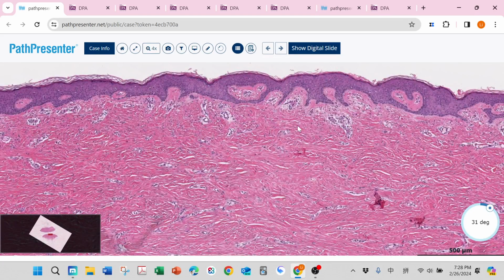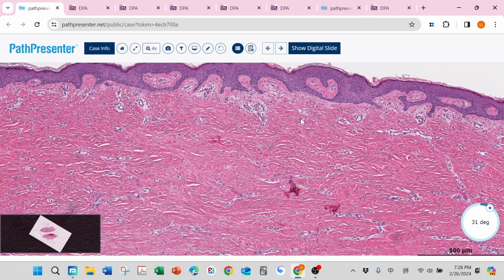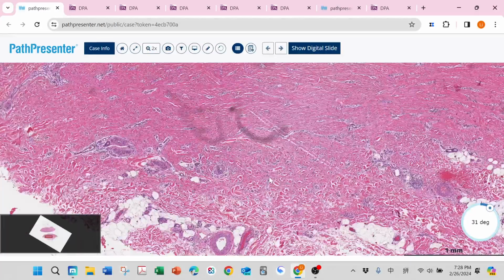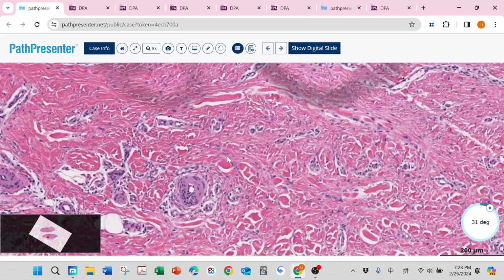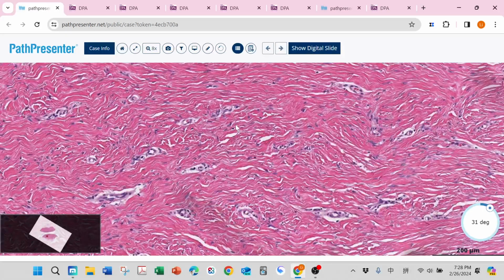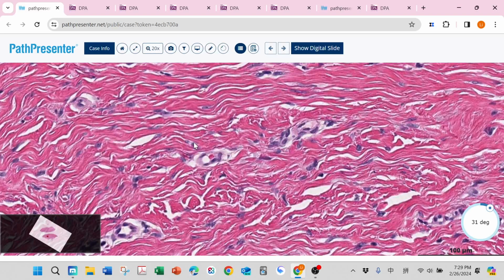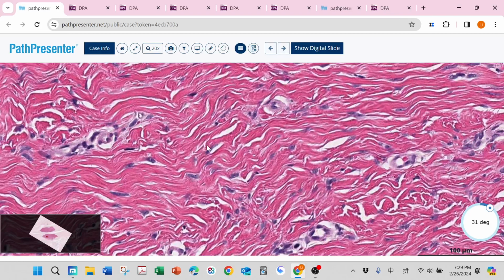from the superficial dermis, papillary dermis, all the way down, even going into subcutaneous fat. And then in the periphery, you usually see this characteristic collagen trapping by the spindle cells. When you look at the cytology of these cells, they are polymorphic but still bland looking. They do not look identical. They have different size, different shape, but are not really atypical cells.